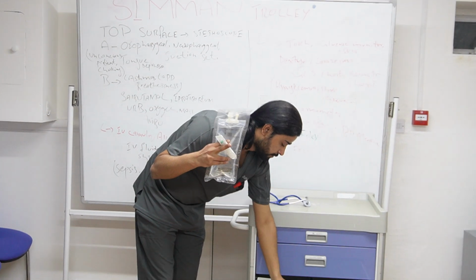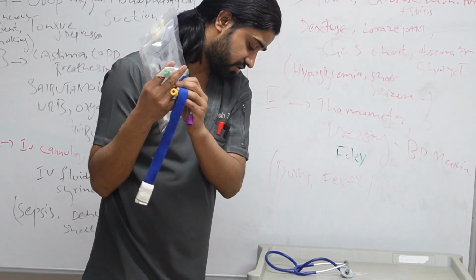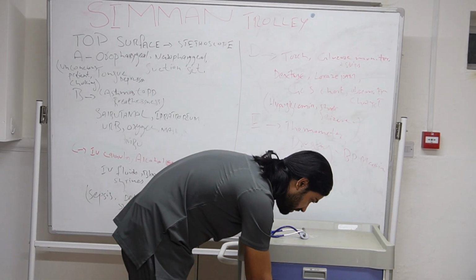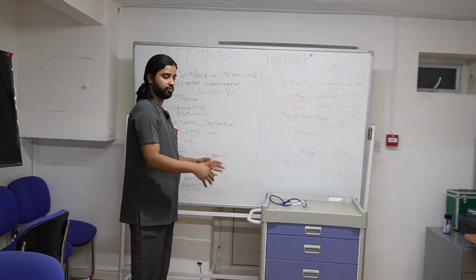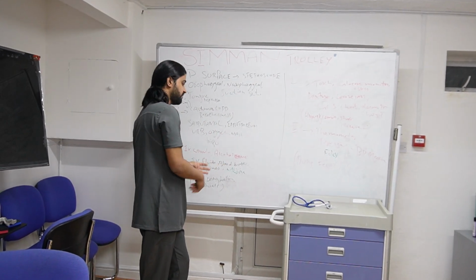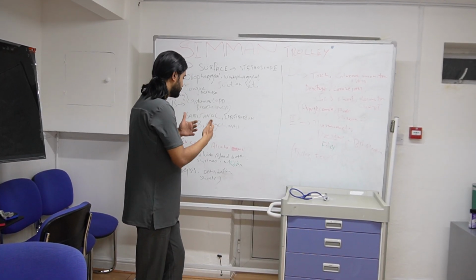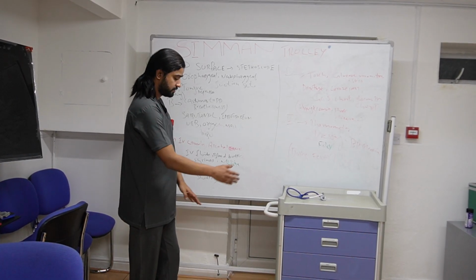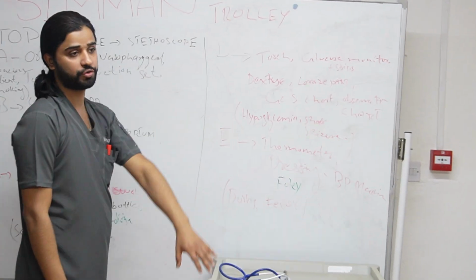Alright. Blood tubes in this row. Tourniquet will be in this row. Alcohol swabs will be in this row. Alright. So blood products will be in this row. So things you need for circulation, when you notice BP is low, then you are going to put in an IV cannula, you are going to take blood samples, all these things will be in C part, alright? The third row. Fourth thing is D, fourth row.